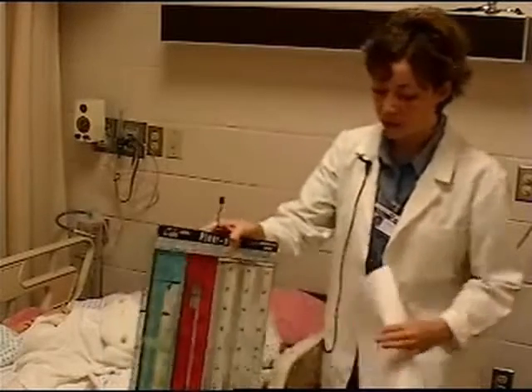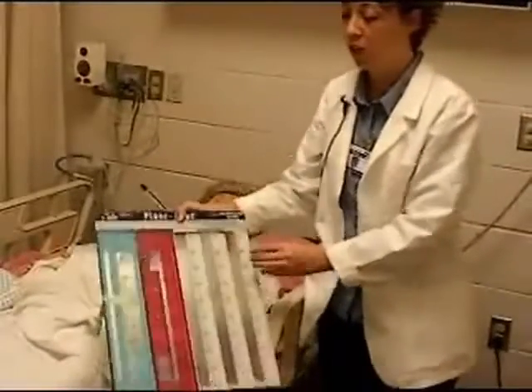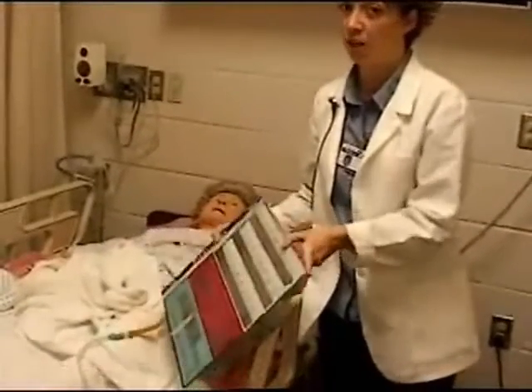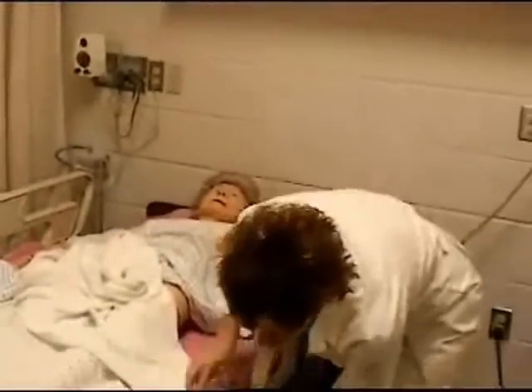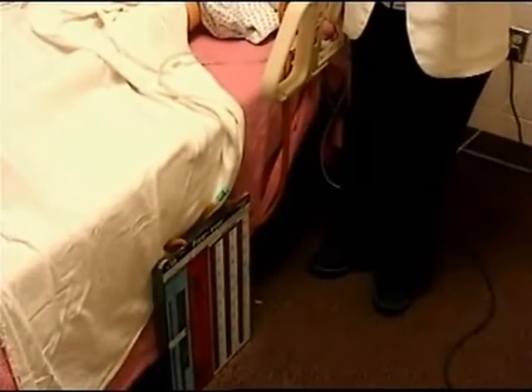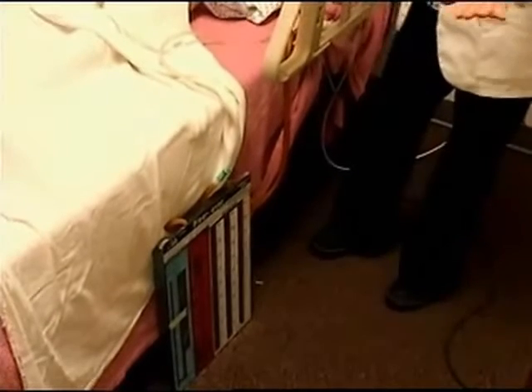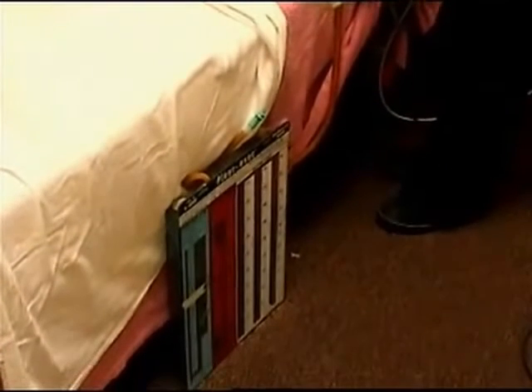So when you come into the patient's room, you need to make sure that this is in an upright position. This should not be laying down or tipped onto its side at all times. So some of them have hooks where they'll hook onto the bed. Some of them have a flat bottom so that they'll be standing upright. So the first thing you want to do when you walk into the room is assess and make sure that that's standing up. You'll introduce yourself to your patient.